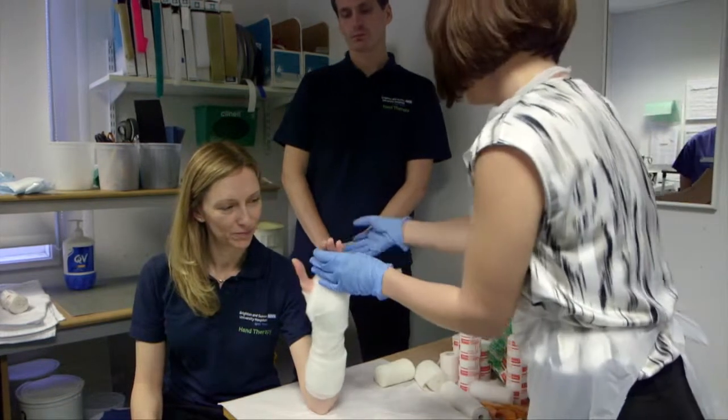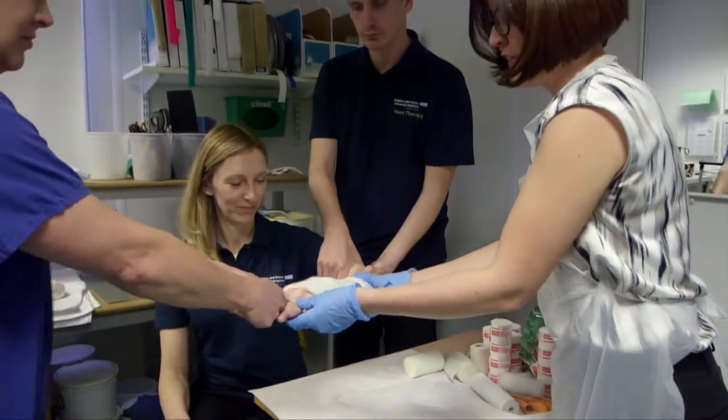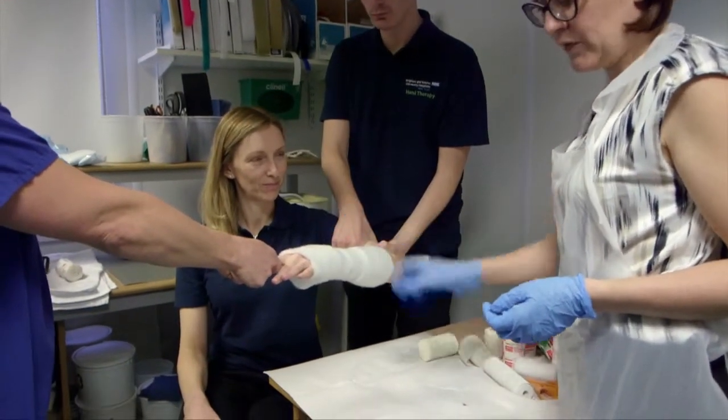After appropriate analgesia is given, traction is applied for two minutes, the distal radius fracture is disimpacted and then reduced and held by three-point moulding.